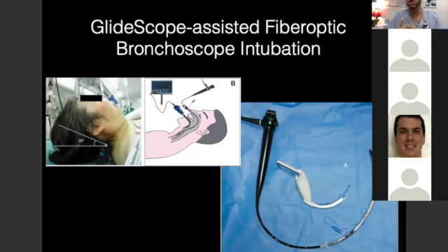We go up by 0.025 mics per kilo per minute until we get to our endpoint, which is a respiratory rate 6 to 8. Patient is a POSS 2 to 3. Maybe in that time I've titrated in some midazolam, 0.5 milligram at a time, 1 milligram at a time, but not so much where I'm going to lose cooperativeness.